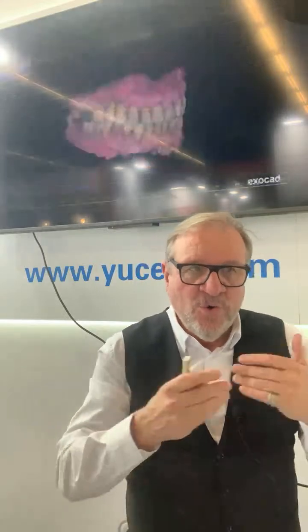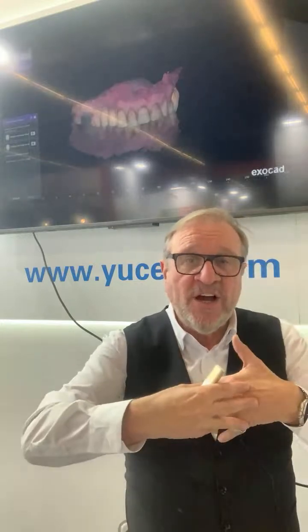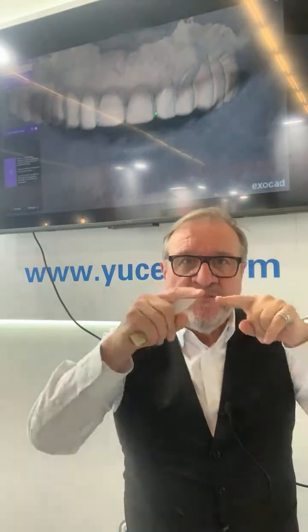So we take the picture of the shape as we have already done so many times now. You see the picture like that each time, and we're going to design on exocad. So we're going to make some veneers. So we make a mock-up presentation, integrate into my picture, you see, and we have to make calibration between the two pictures. When it's done, I have the correction.